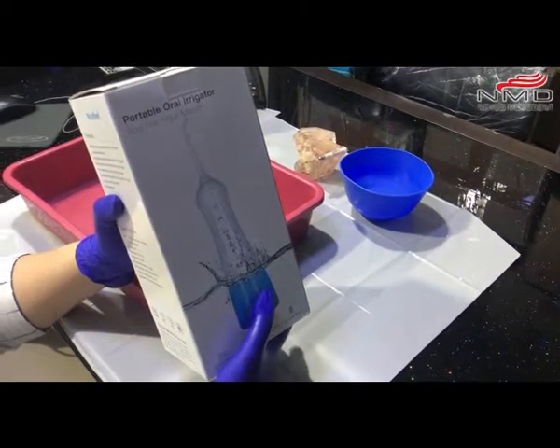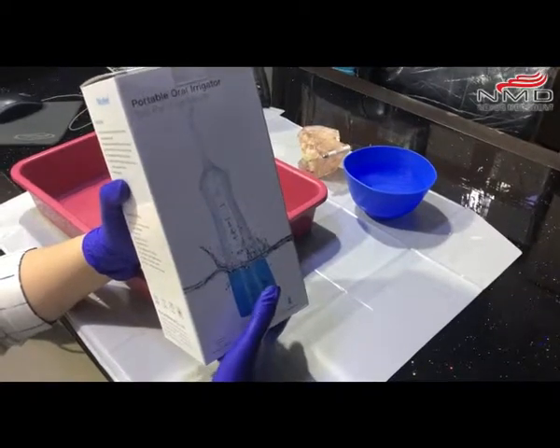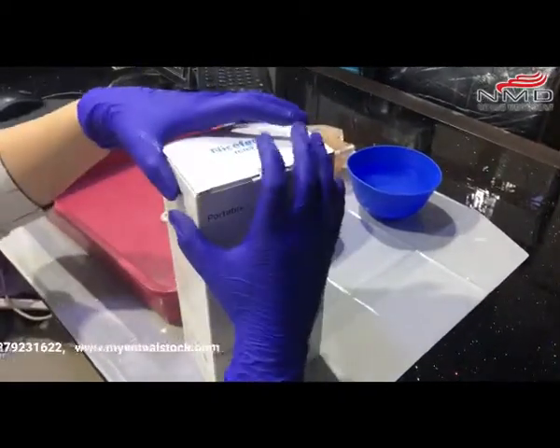Hello friends, back again with a new product. This is the Water Flosser from NMD Nexus Medodym.